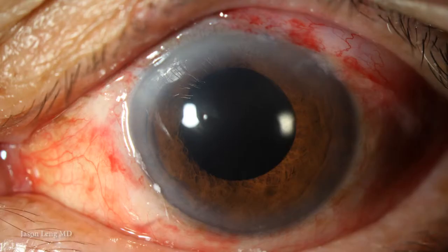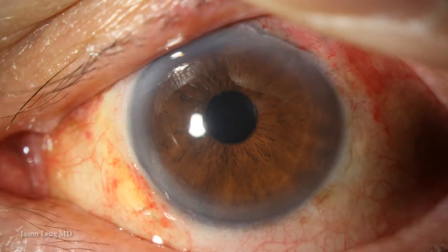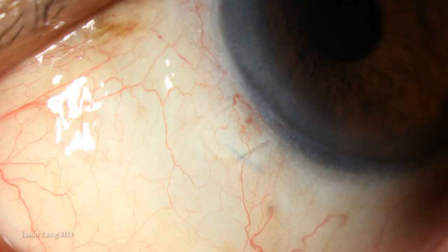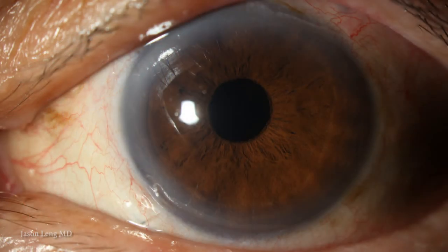Here's a photo of the patient on postop day one — he's comfortable and doing amazingly well, with 20/20 uncorrected vision. The cornea is clear, the lens looks very nicely centered, and the patient is happy. At one week and one month postop, the conjunctiva and sclera have healed very nicely. You can visualize where the haptic is tucked a few millimeters into the intrascleral pockets. Overall, the patient is very happy and comfortable with good visual acuity and a stable, well-positioned IOL.